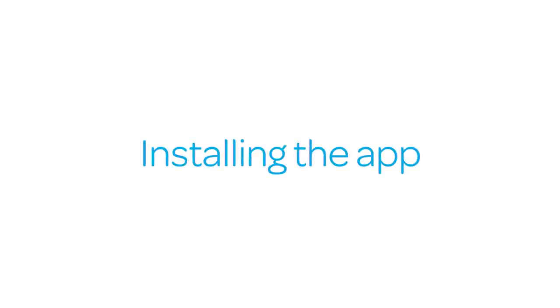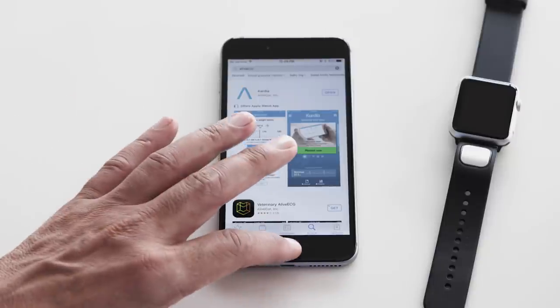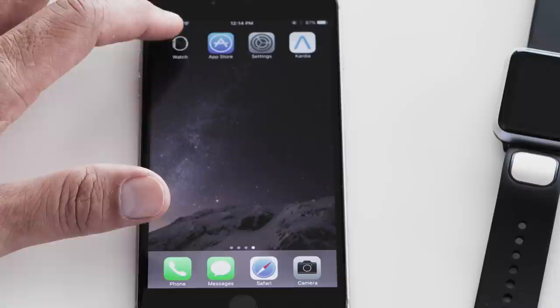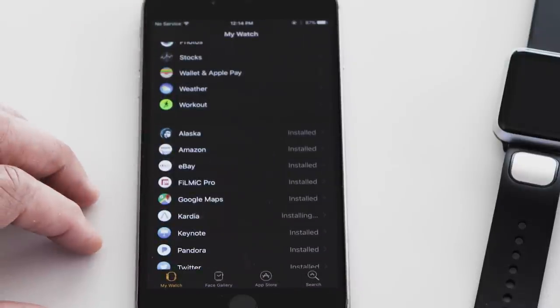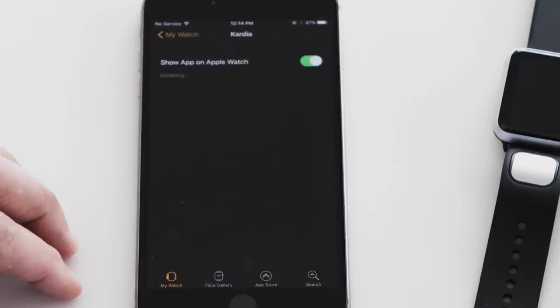Installing the app. On your iPhone, download the Kardia app from the App Store. Now open the Apple Watch app on your iPhone. Tap My Watch and scroll to find the Kardia app and tap the Kardia icon. Then tap Show App on Apple Watch.